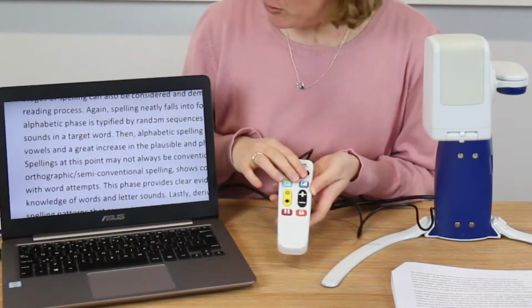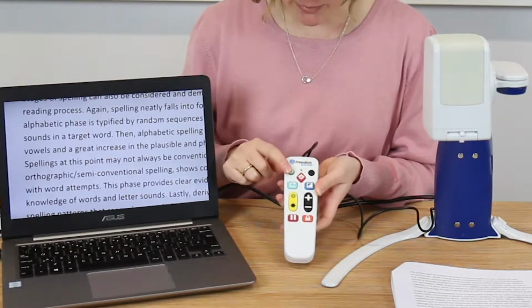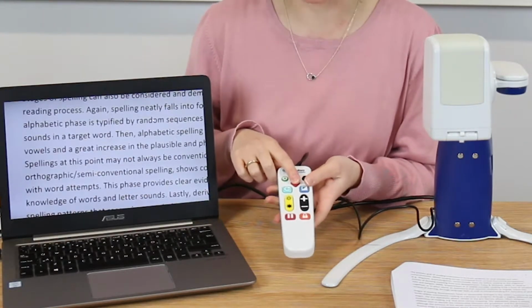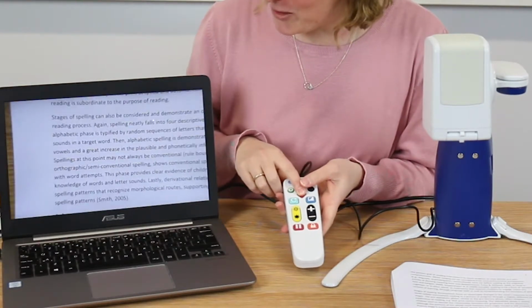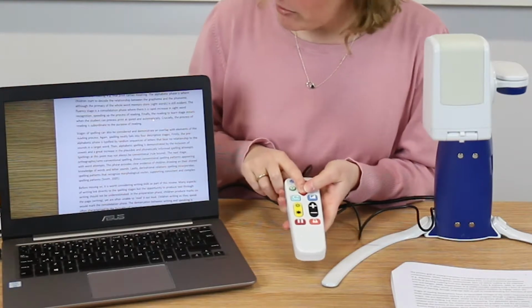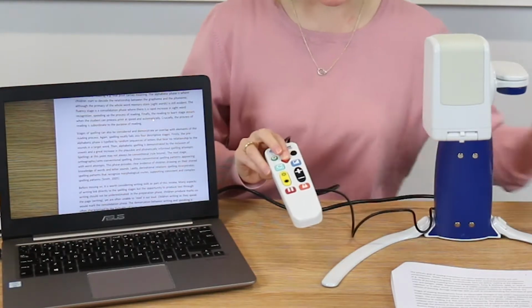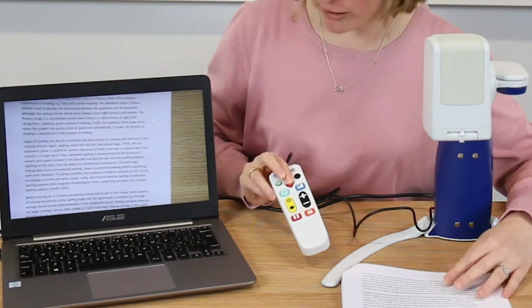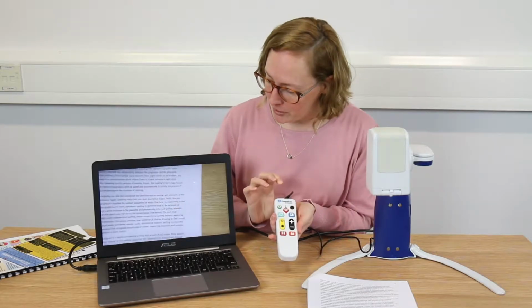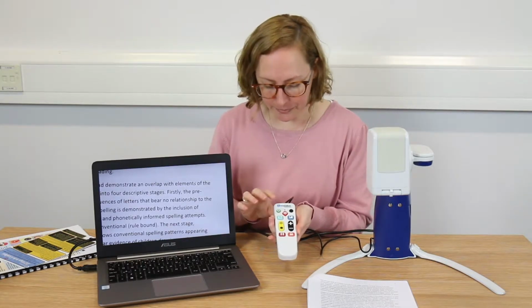So just to run through the basics here, you've got a power button, you've got what I technically call a zoomy outy button. What this does, if you press and hold it, it will zoom you to ×1 level, so that you can then reorientate the view or reorientate the focus of the camera, and then when you release the button, which I'm going to do now, it will go back to the original level of magnification.